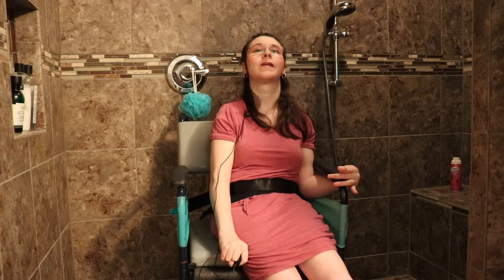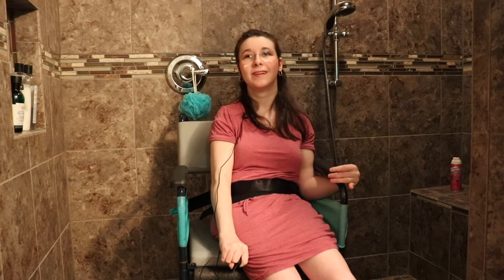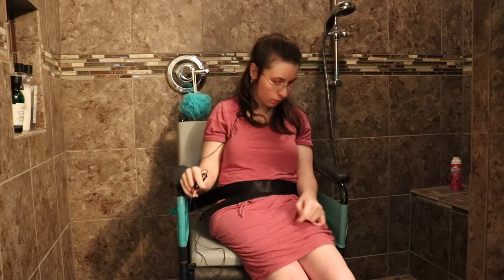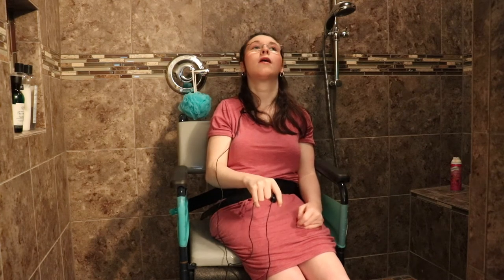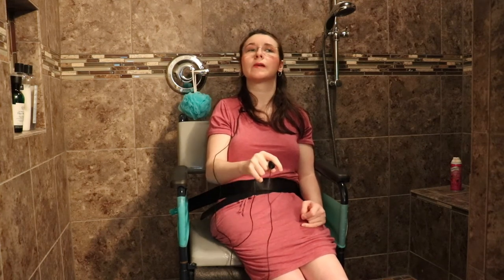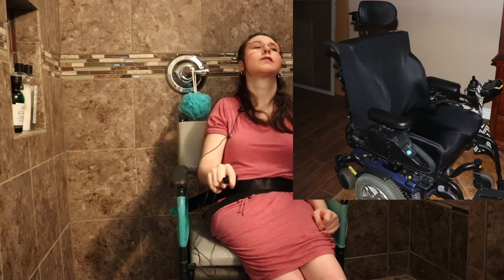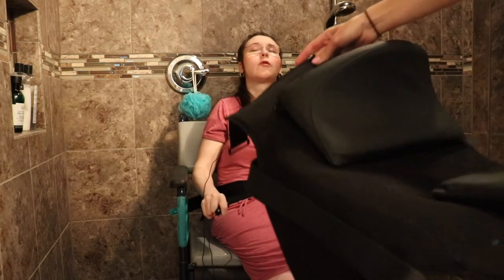My arm would always get red after the shower, like it is now. I'm going to also include a picture of my other wheelchair to show you guys what works for me and what I need for support.